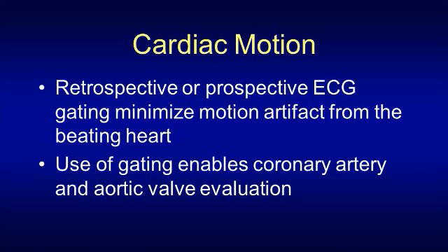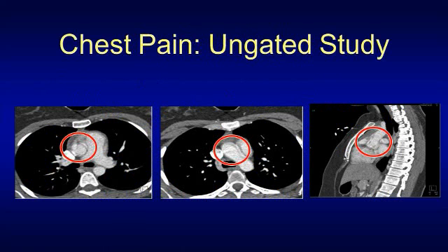Particularly in coronary artery imaging and aortic valve evaluation, we have to image with gating so that we maximize our temporal resolution and decrease the motion artifacts that limit image quality. Let's look at this ungated study on a young woman who came in with chest pain and has what looks like a small dissection in the ascending thoracic aorta.